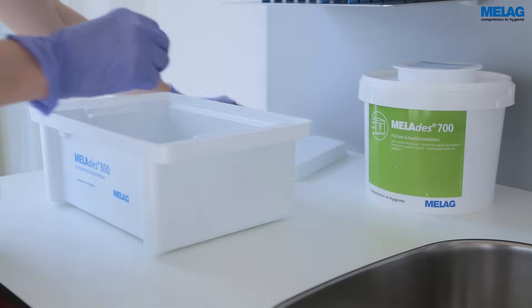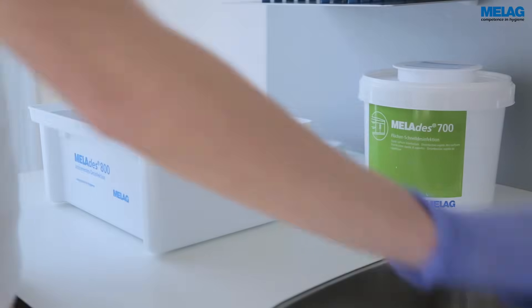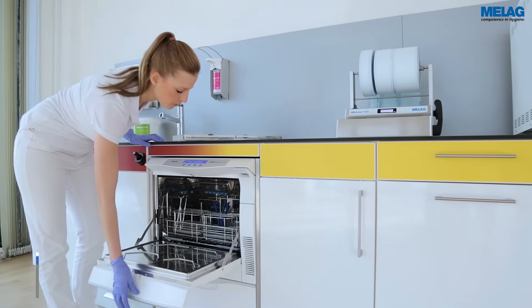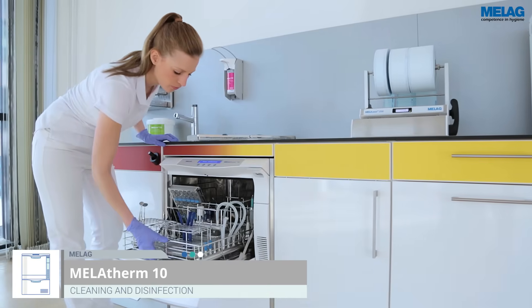We recommend pre-cleaning to remove hardly soluble dental materials before the cleaning and disinfection process in the MeLag Therm 10 washer disinfector.